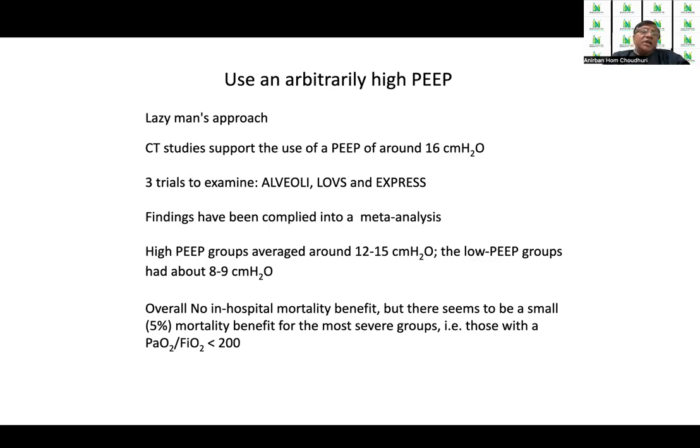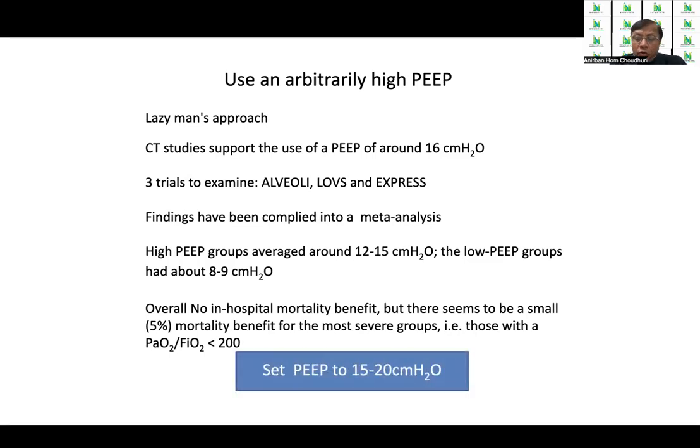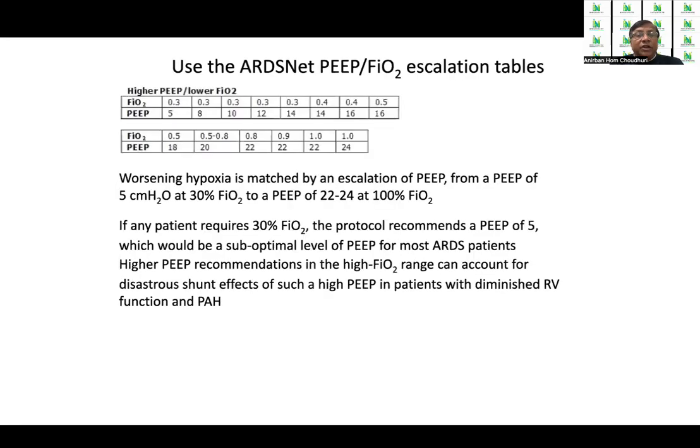So an arbitrarily high PEEP to use, well, doesn't make too much sense, but yes, if there is no other means, one can look for it. There may or may not be any benefit. So in this, you set the PEEP to around 15 to 20 centimeter of water.